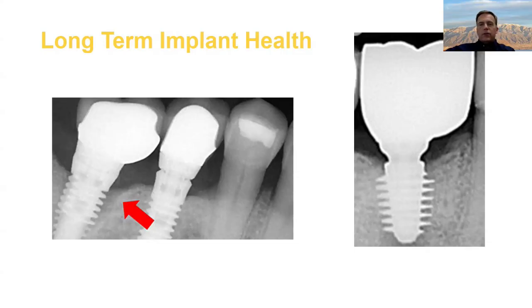Now, the next frontier in implant health, now that we've kind of gotten to where implantation is fairly predictable, is I think going to be tissue attachment to the abutment. There's a couple of implant companies that are talking about this now, and I think it's going to become a topic of greater interest in the near future. I think we're seeing mostly advertising and anecdotal evidence at this point, but I would keep an eye on unbiased academic studies that are coming out to look at this, because I wouldn't be surprised if in the not too distant future, most of the implants we're placing, we're also putting an abutment on them early and then allowing the tissue to seal up against that. So that way we just have one more layer of protection for our implant.